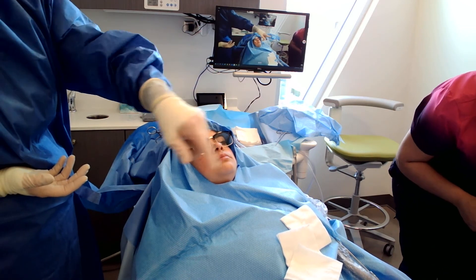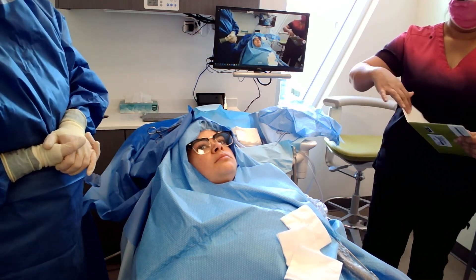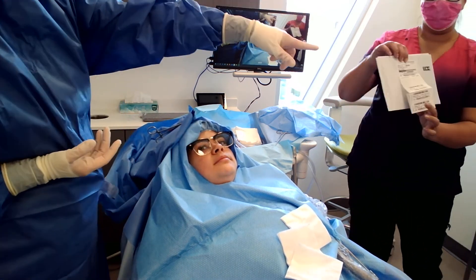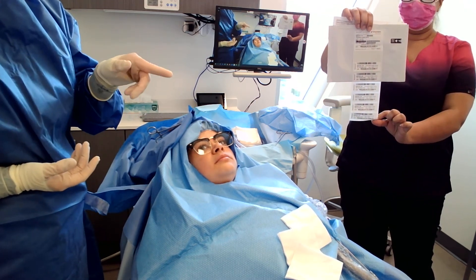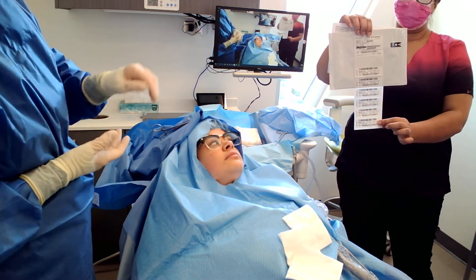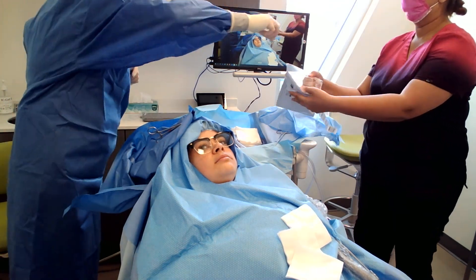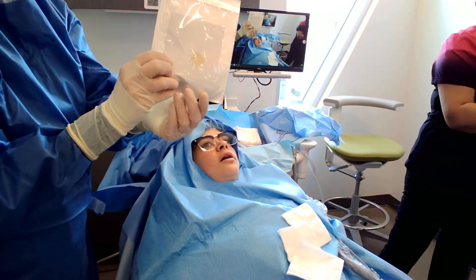Let's open that collagen membrane. This is a Stroman membrane — it will have a reference number and everything as well. It's ridiculous how much packaging there is — that's all the stickers. We need it for grafting to go in the patient chart, but we also keep a running binder in case there's a recall or some issue. Look at how many envelopes are in envelopes just to get that little tiny square out. That was three envelopes. Look at the size of this membrane — it's tiny.